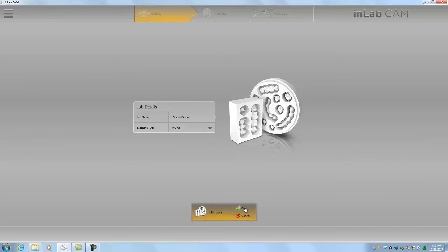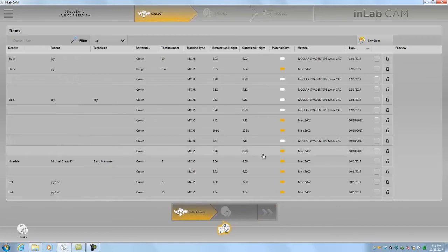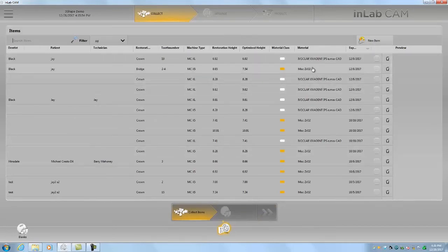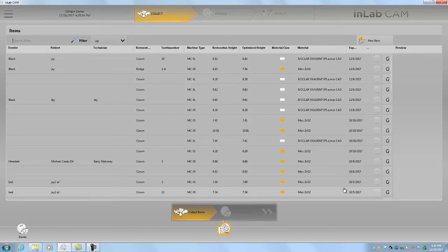We'll click OK and now we get to select our units. What we see here is a list of all previously manufactured units. I'm going to click new item.